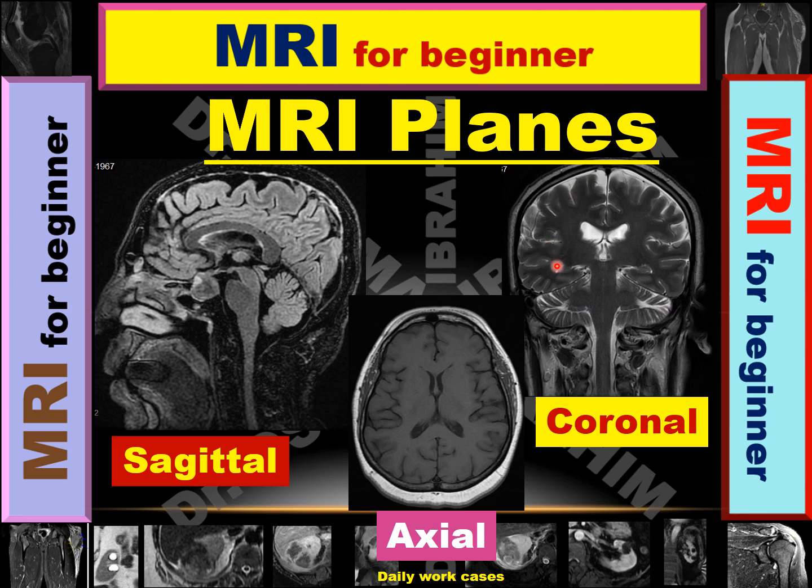However, this is the coronal plane, representing the frontal view, as represented by the plain radiograph. This is a frontal view or coronal plane in the MRI. And the axial image, like CT, is the other plane. So we have three planes: axial, coronal, and sagittal. And now we can discriminate the three images from each other.